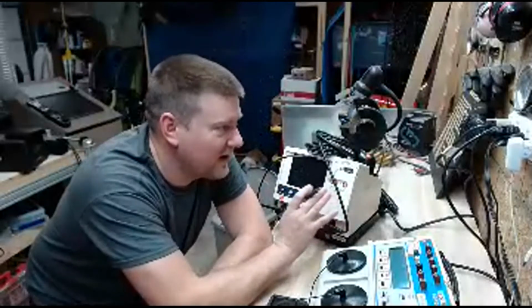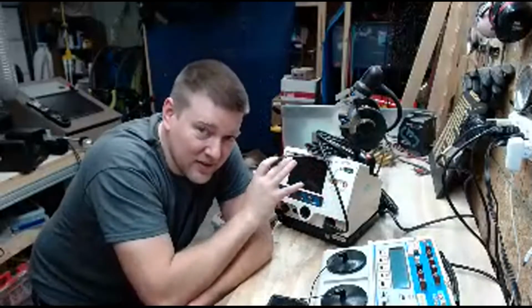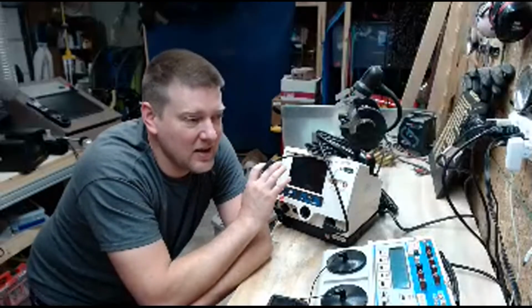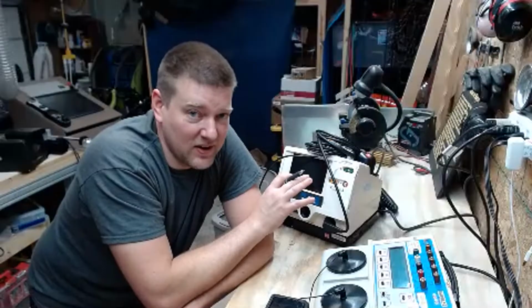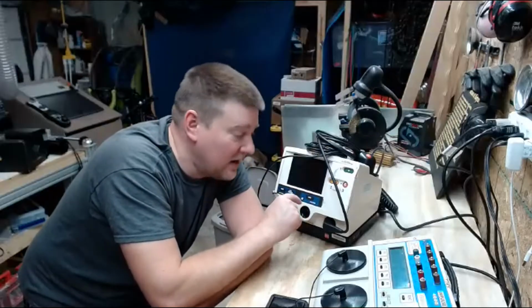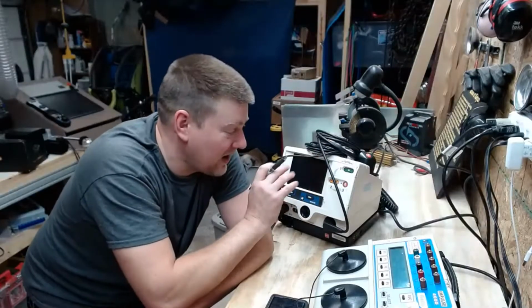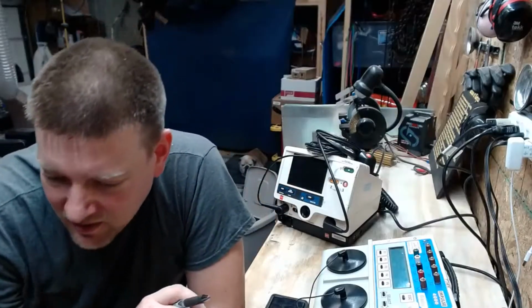please do not falsify documentation. People can find that. These devices are smart. They know when you disconnected the battery. They keep a log of that stuff. They keep a log of every key press. So if you are not doing your PM correctly and somebody wants to go through and see what quality PM you're doing, all they got to do is pull the key logs. So guys, follow the checklist and do your PM correctly.